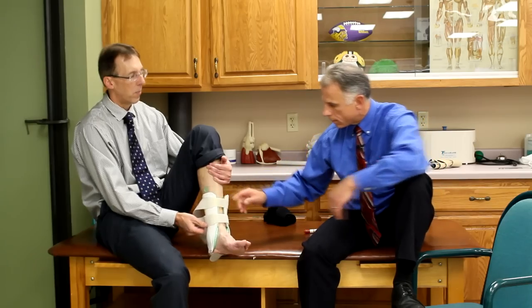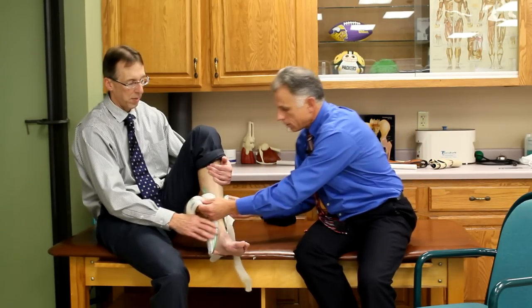So we've got the three braces: the Yoso, the ASO, and the Air Stirrup. Those three will pretty much cover almost every situation you may run into.